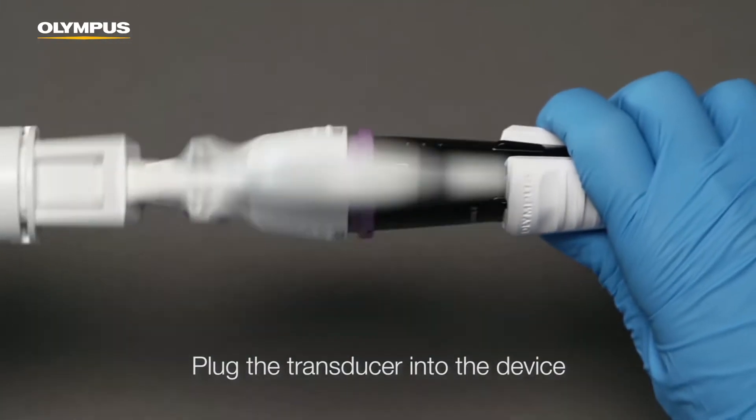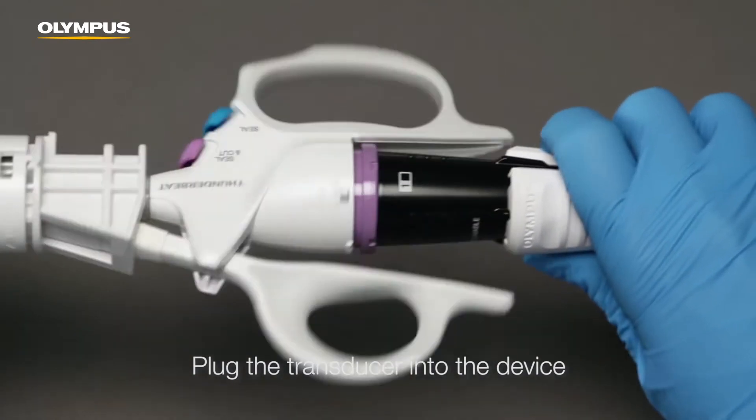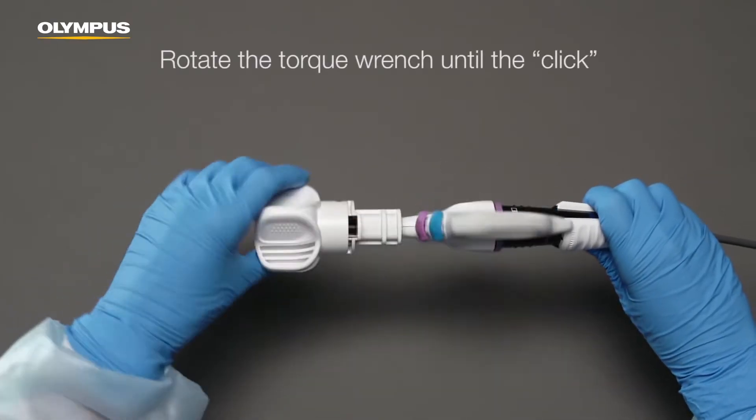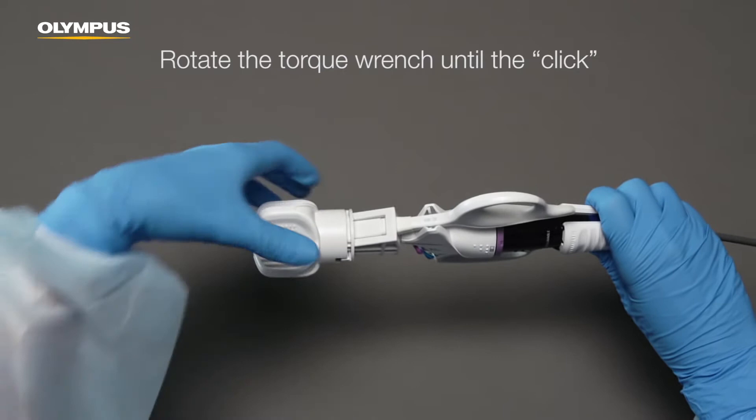Hold the stabilizer tightly and rotate the torque wrench clockwise until you hear a click. The final rotation may require more force.